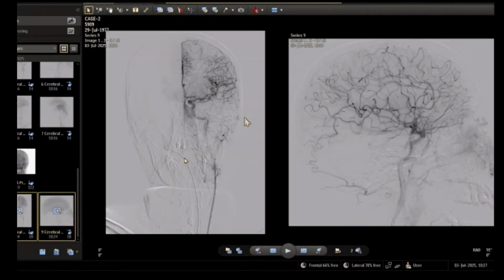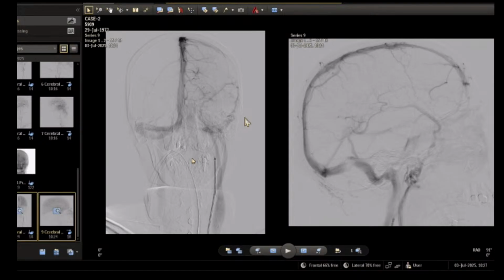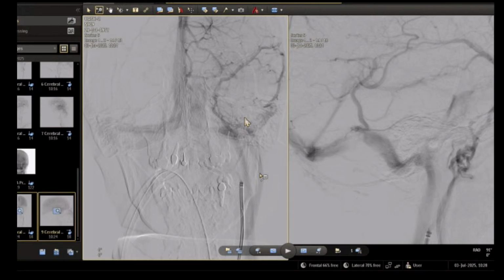Okay, I asked my colleague Ravan Maratlı to delay the angiography till the end of the venous phase, and now you can see that the patient has a transverse sinus stenosis, and on MR this stenosis is on both sides. In my point of view, the headaches most probably come from this stenotic portion of the transverse sigmoid junction.